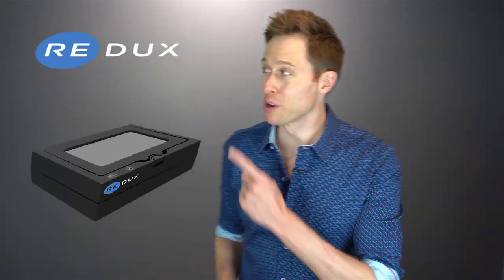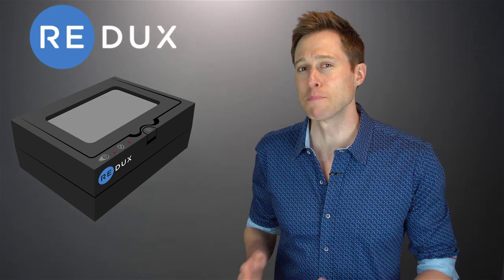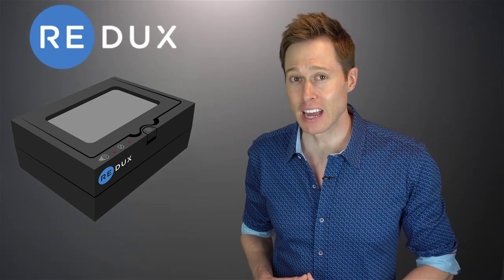In this video, I'm reviewing the Redux Professional Hearing Aid Dehydration System to see if it is really the best way to save your hearing aids from water damage.